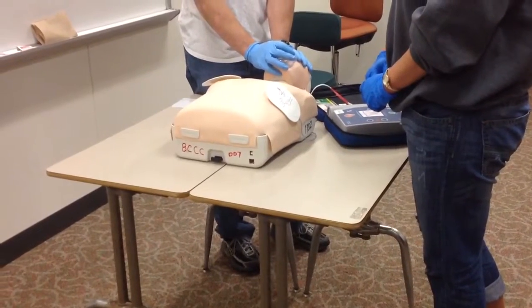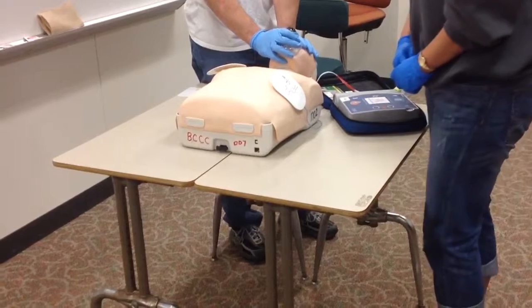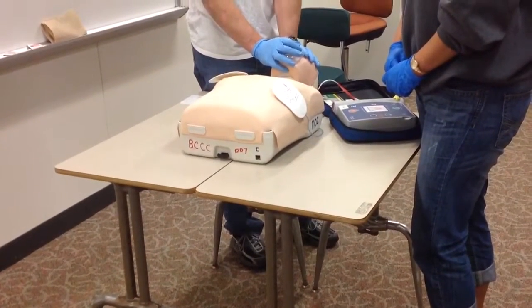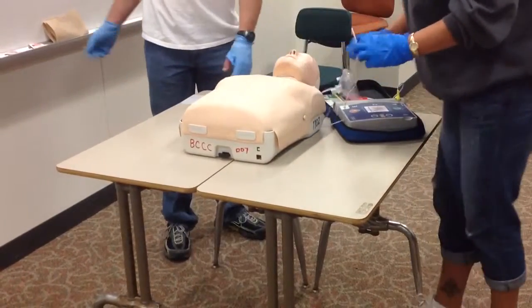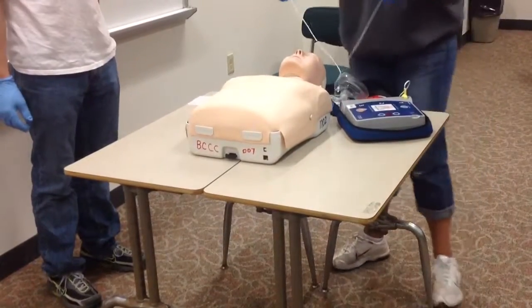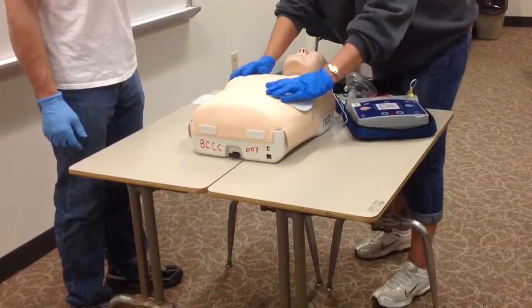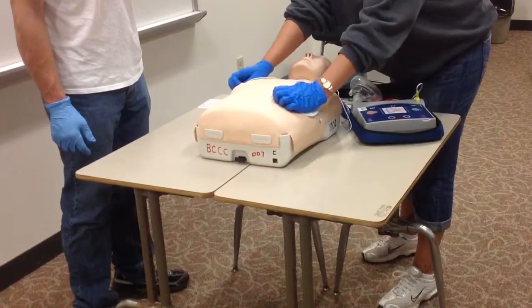Now, there are a few special scenarios which may cause problems using the AED. First, if the patient has a hairy chest, you must use a set of either pediatric pads or an extra set of pads in order to remove the chest hair before reapplying the pads onto the patient. So you'll secure the pads and then quickly remove them in order to remove the hair.